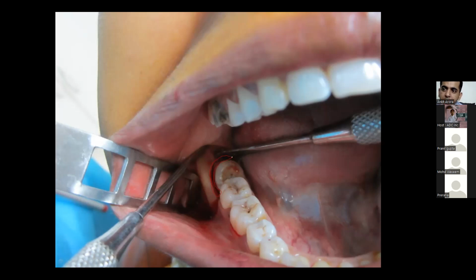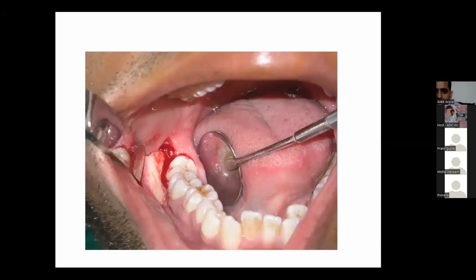You will never be at fault. Maybe more might be required in 10-12% of the cases, but in 80-85% of cases, one bar depth and one bar width of the 703 bar would be sufficient for the process. So this is how it looks like.